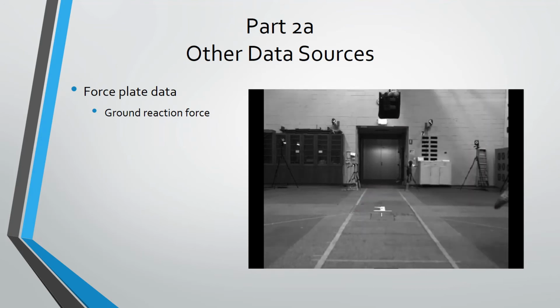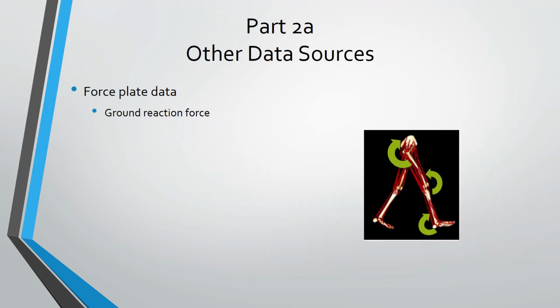Now when we consider the body to be a series of rigid segments, we can calculate the joint moments up the segments of the body from where the body is contacting the force plate. And this is incredibly useful for the investigation of mechanisms of injuries, and I'll touch on that more later.